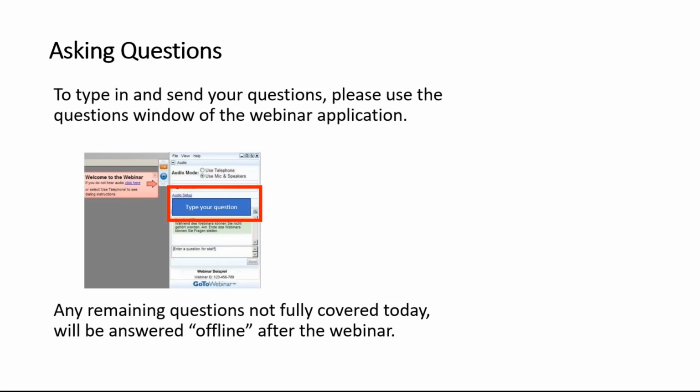Of course, I believe that en face mode is much easier to perform. It saves significantly your time. Instead of 20 to 30 minutes to perform an FA or waiting while patients are examined with FA, you can just do OCT in a few minutes and save another half an hour. I think it's a significant time saving for our daily practice. Just spend 2 or 3 minutes for OCT instead of 20 to 30 minutes for FA. Okay.